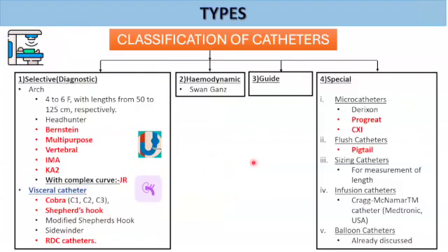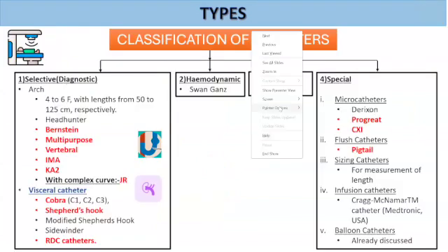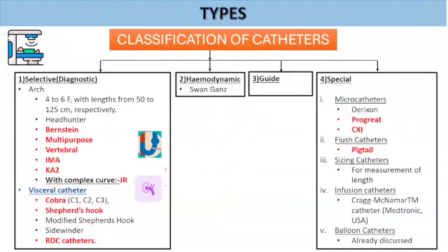This classification, don't get scared by this classification. Coming to hemodynamic catheters, we don't need to learn about hemodynamic catheters. Guide catheters are rarely used. In microcatheters, I'll come to special catheters.